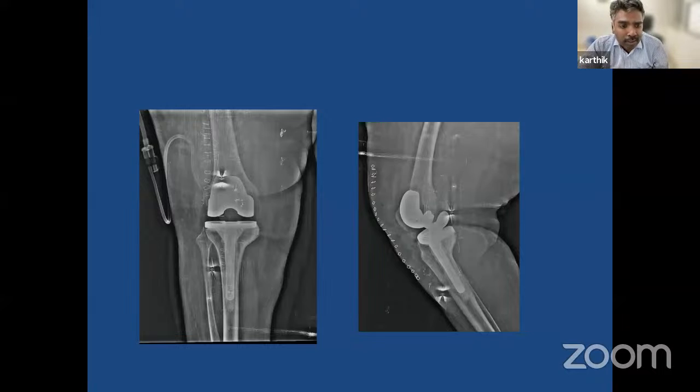So this was the shortest cemented tibial stem we had, so we went for that. And the rest of the defect, we just put cement there. Now the calf-thigh impingement is what Dr. Bharat was mentioning and you were mentioning. So in that case, as you suggest, we finish the femur and then come to the tibia. That's what you suggest, right? Yeah. Okay.